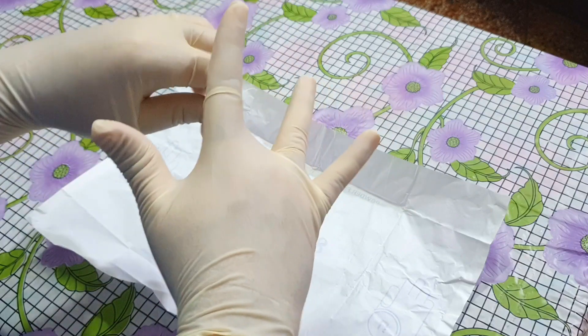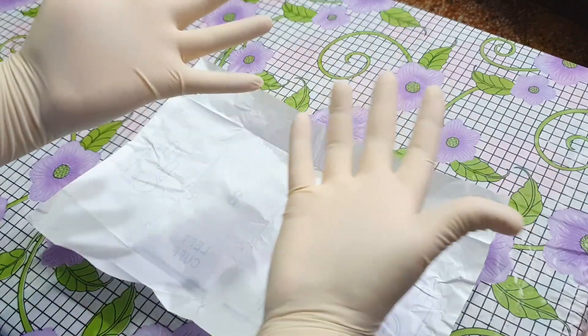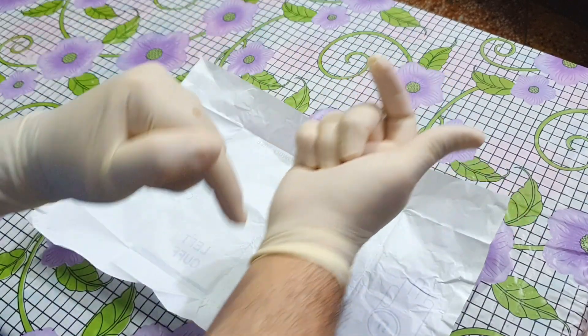However, they cannot touch any other object which is not sterilized. As you will be wearing the gown, you can slide the gloves over your gown sleeves.